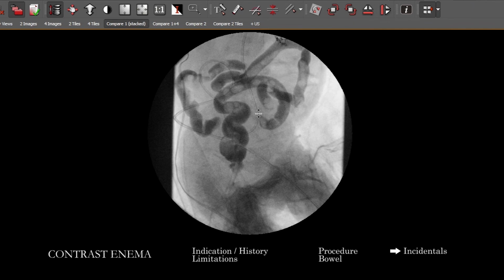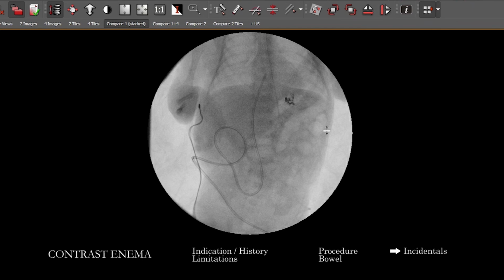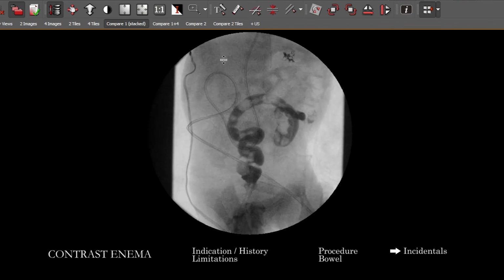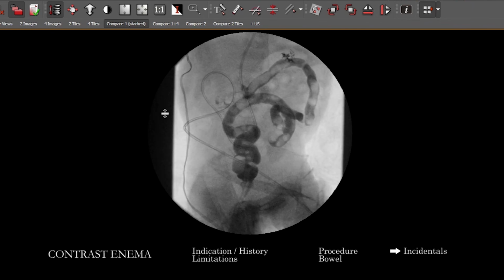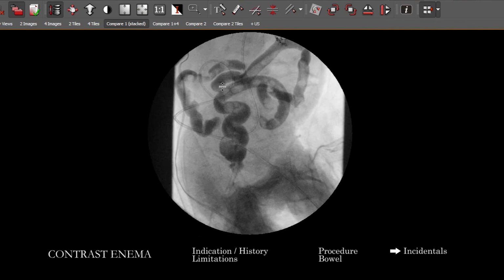As you're going through the study, you want to make sure, at the end, as we do for all imaging, to at least remember to eyeball the remaining anatomy, especially if the patient has not had prior imaging of parts like the lower chest and abdominal anatomy, just to make sure that we're not going by something very obvious and incidental.